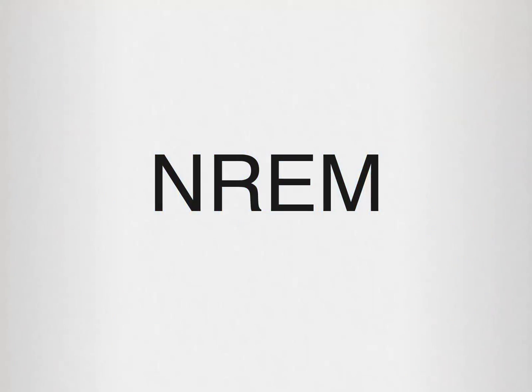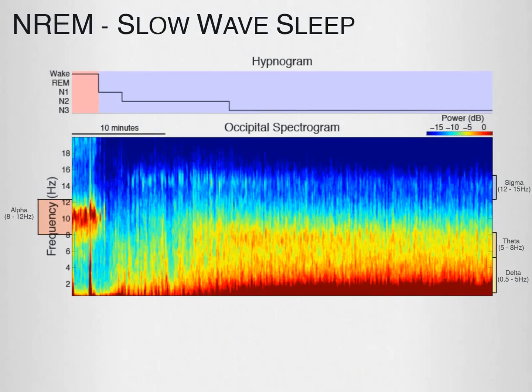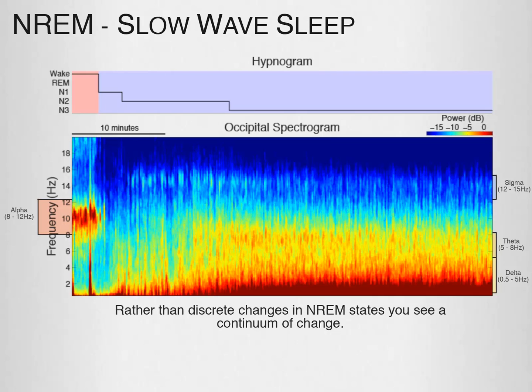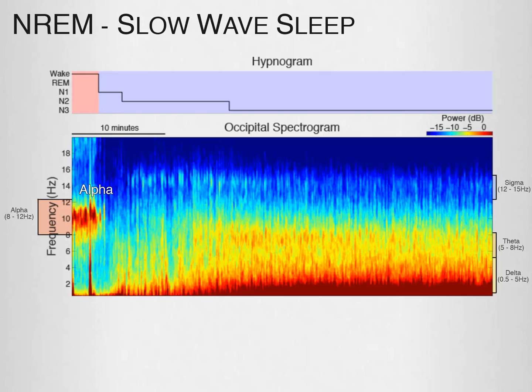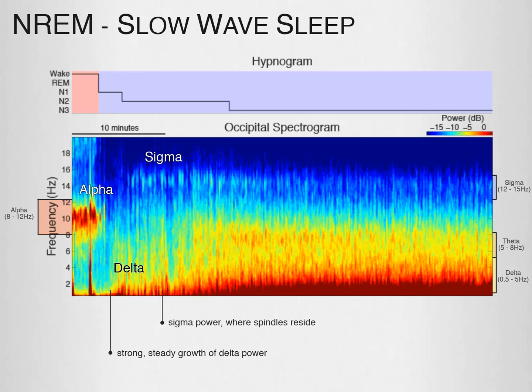Here's an example of classic non-REM sleep, where the subject is in N1, transitions to N2, and then N3. In the spectrogram, rather than discrete changes in non-REM states, you see a continuum of change. At the start, you have the eyes-closed alpha of wake, which disappears once the subject falls asleep. What you observe for the rest of non-REM is a strong, steady growth of delta power. After delta increases a bit, you start to see sigma power, where spindles reside.